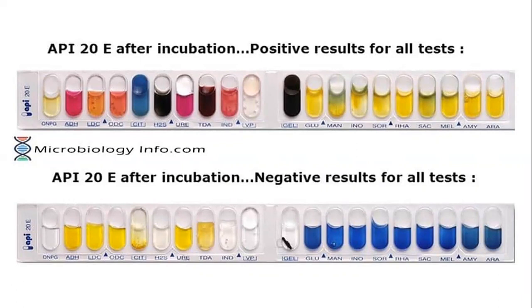So these are the colors. In a later video, I will discuss each and every chemical reaction involved in these tests. Just keep in mind that when all the tests are positive, such colors are produced, and when all are negative, such colors are produced. Why these colors are produced, I will tell you in the later video.